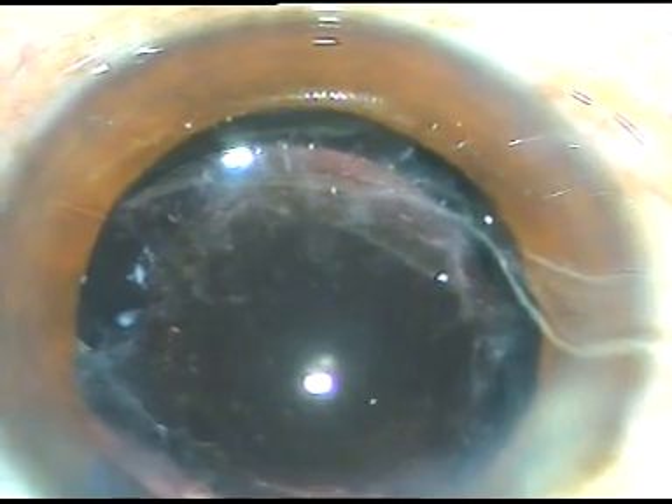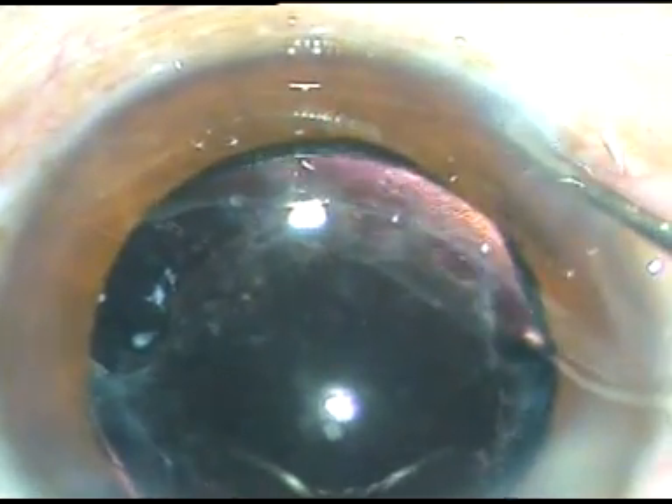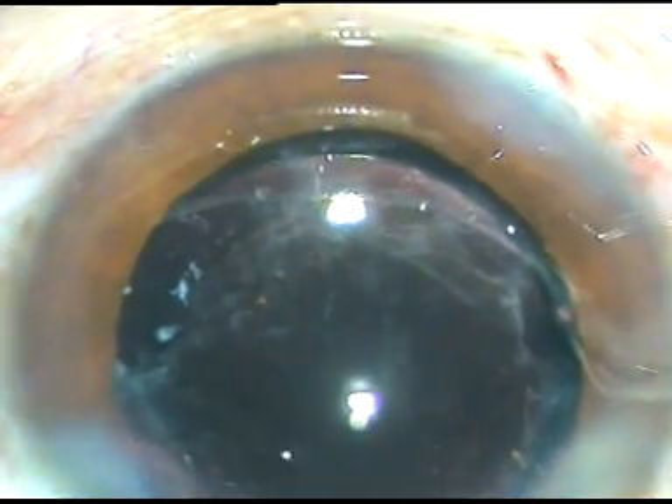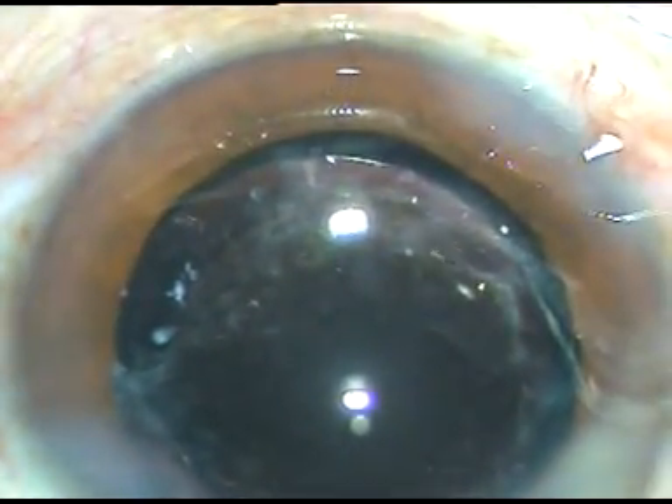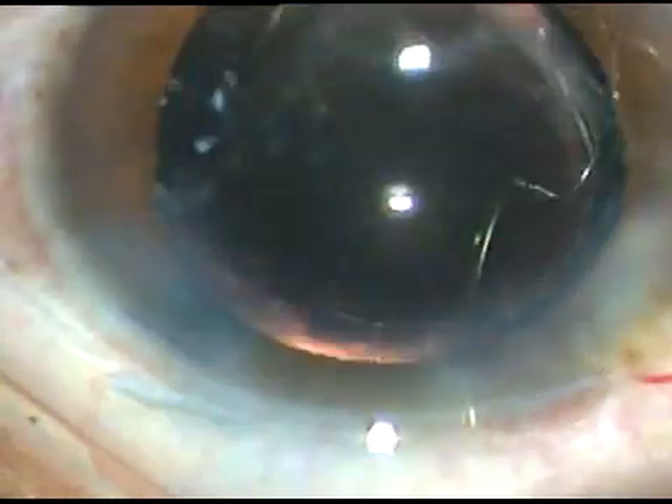My colleagues, we must be very meticulous in removing this viscoelastic substance to avoid post-operative rise of intraocular pressure. If you have done a nice surgery but the intraocular pressure is raised, the patient will have steamy corneal edema and pain. Now the side ports are hydrated, these wounds are made watertight, and a final wash at higher magnification is given with BSS — even for free-category patients, I give this final wash with BSS. Thank you very much for your attention; I hope this video will help you in your practice.